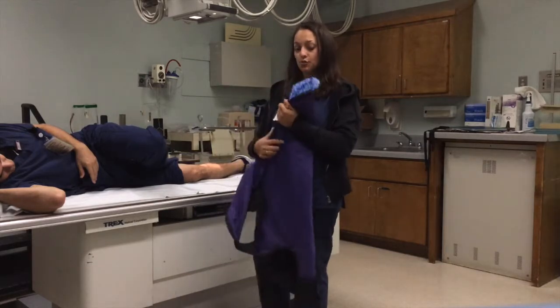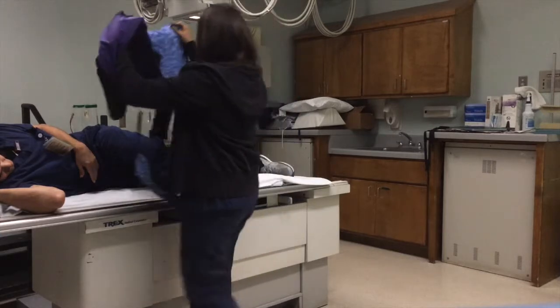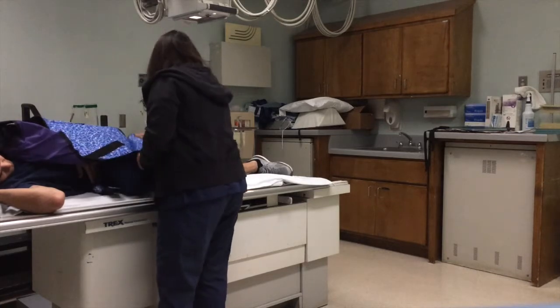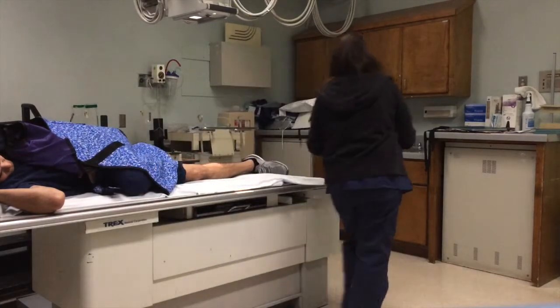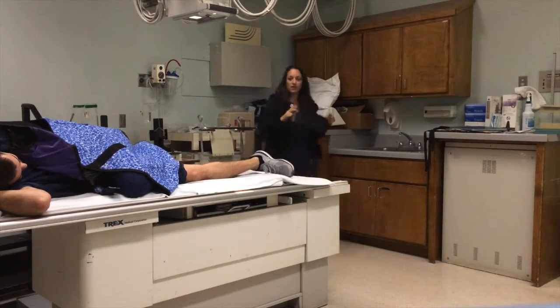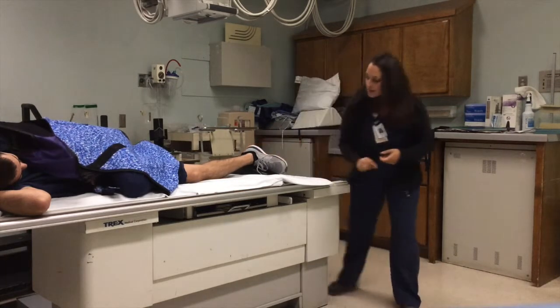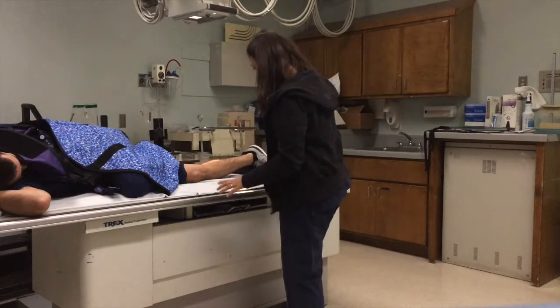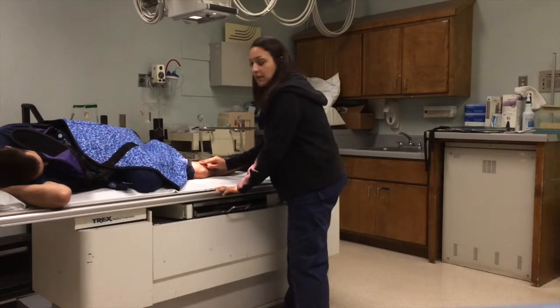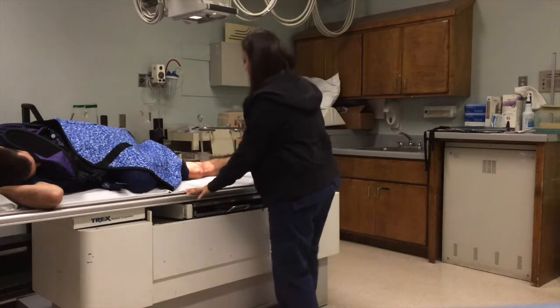I'm going to go ahead and put this back on top of him so he is protected. There you go. That should do it. Sorry if that's uncomfortable. So there's his knee. I'm going to support his knee too. Now to use what I have, the wedge. I'm going to put this just underneath his foot a little bit to rotate that knee so it is perfectly perpendicular. Now his leg is at a 20 to 30-degree angle. I'm going to feel his medial epicondyle. I'm going to go 1 inch below, and that is where I'm centering.